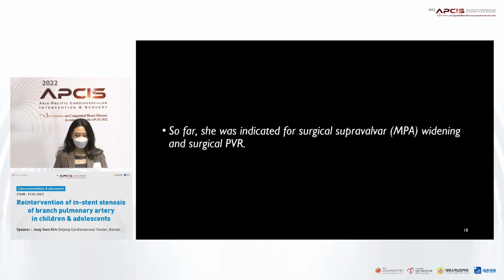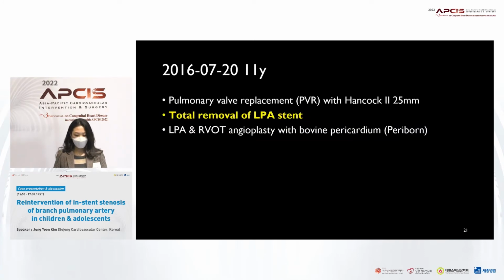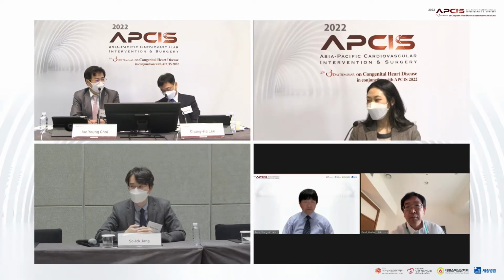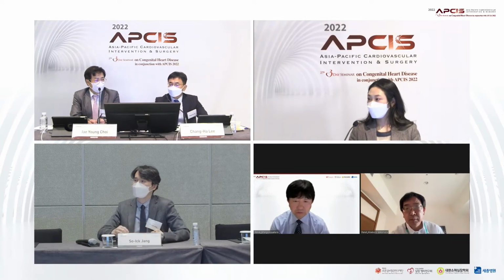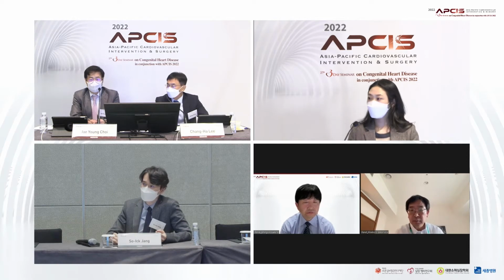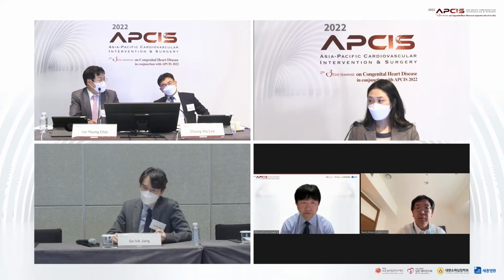It's not a Palmaz stent, so be very careful with the redilation. Yeah, Express stent. I don't like that stent for pulmonary artery. I think the property of the stent is not good for the pulmonary artery. And one last thing: if you make a napkin ring of the stent, then wait for some time, and it would be better to remove it at the next session operation.